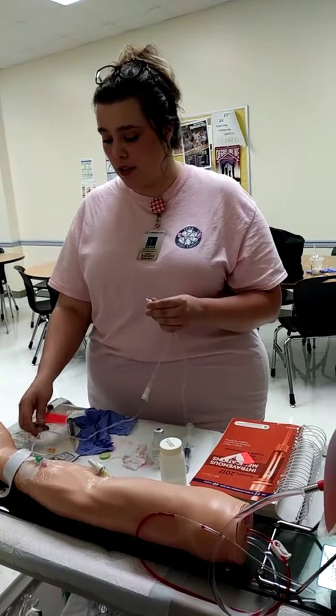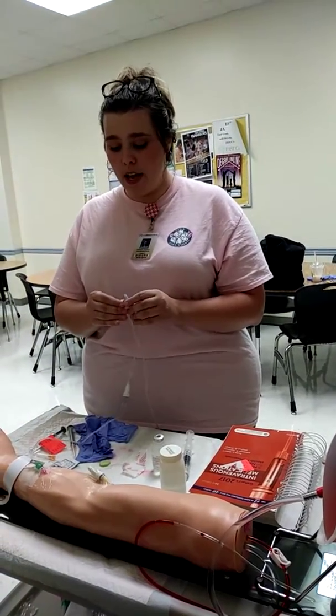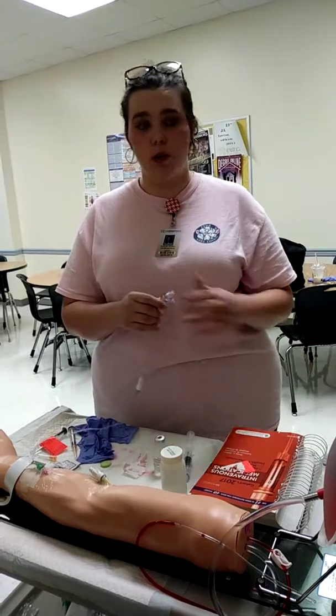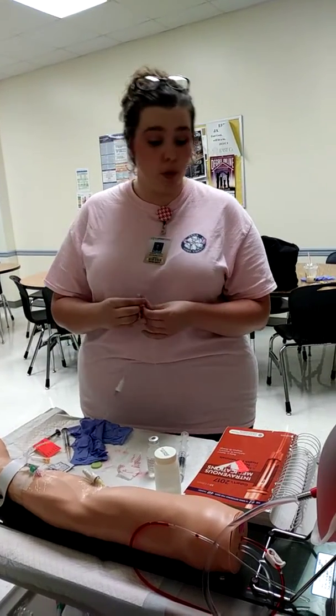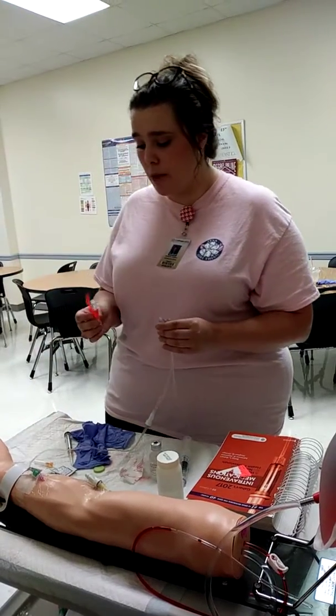Now, my patient does not feel as if there's any serious burning. He's fine. And I'll go ahead and release the IV. Unclamp it. Drops are still set to what they need to be. Patient is good. Now, if it was not compatible, what I would do is fully clamp the IV line. State this was not compatible.